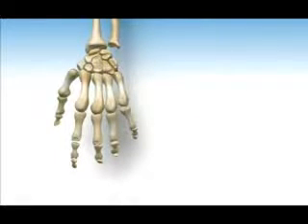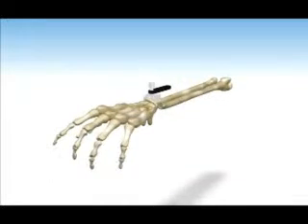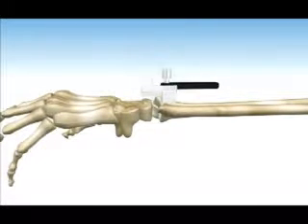Step 1. Locate the PGT guide so that it is positioned over Lister's tubercle and rests firmly on the dorsal surface of the distal radius. Assemble the PGT tab component to the radial block and mount it onto the PGT guide. Insert the tab into the radiocarpal joint, positioning it against the lunate fossa.